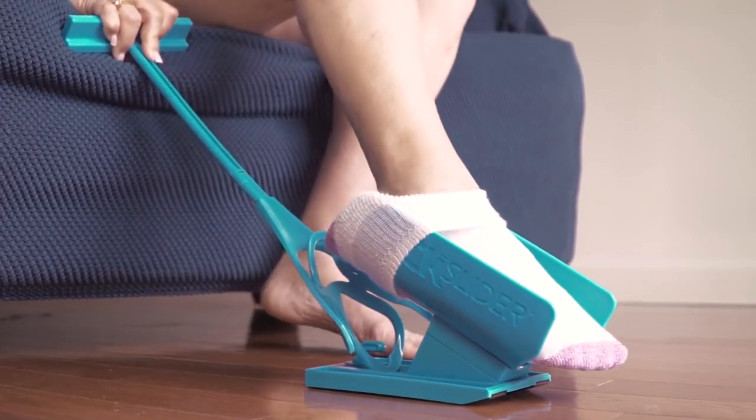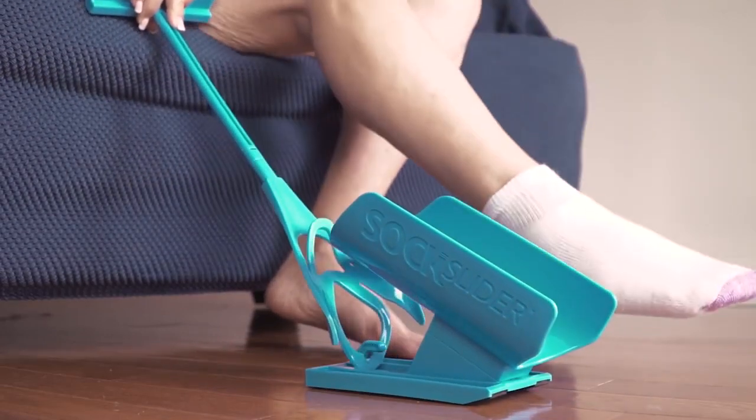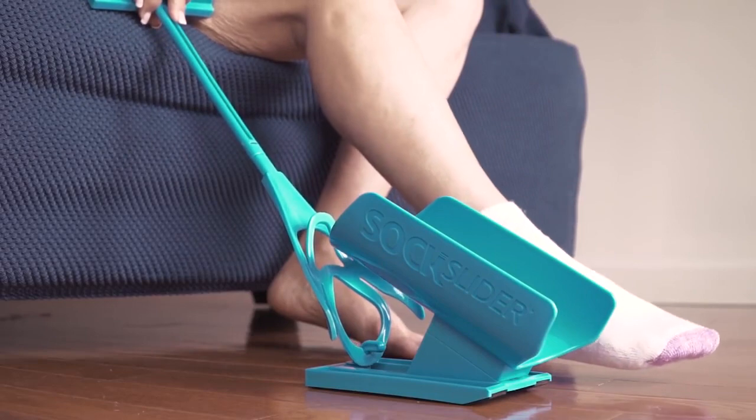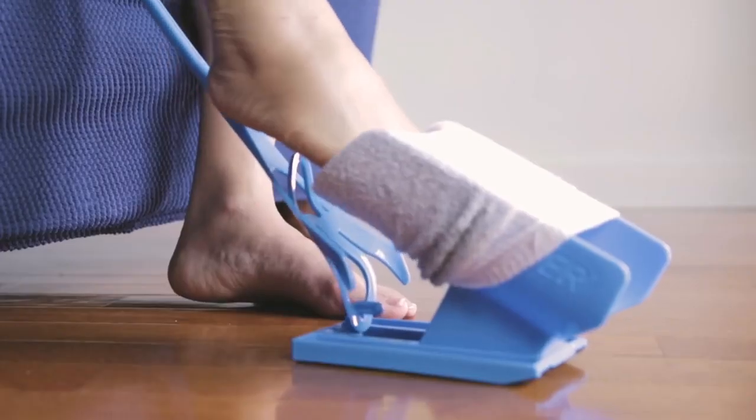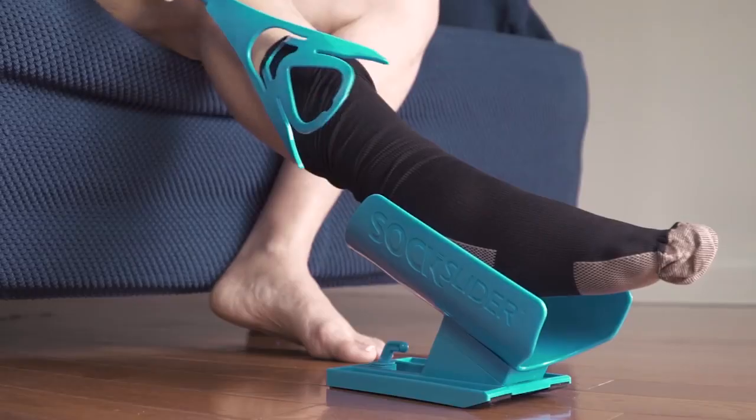Continue until the sock is fully on your foot. If needed, use the handle to hold the Sock Slider system's cradle in place as shown. The Sock Slider system works with any sock, including tube socks and those tough-to-put-on compression socks.